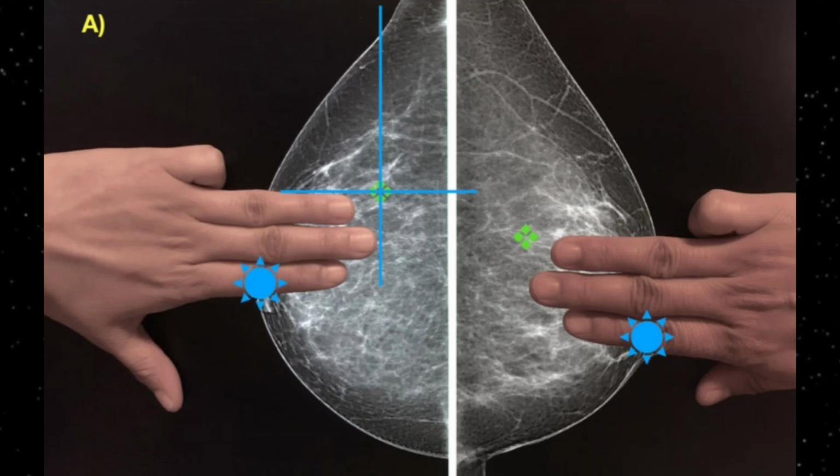So you have to compress. Localized compression should be applied with a compression pedal to pop the abnormalities out on the image. This will help to distinguish the real lesion from the superimposition of the normal tissue. Here on this image you can appreciate that the compression pedal is applied and then the view is taken.